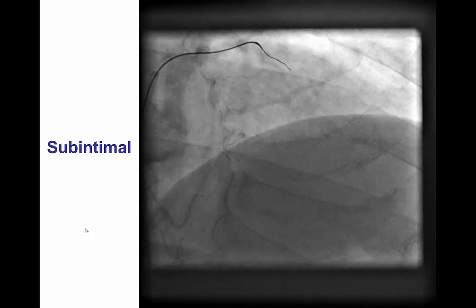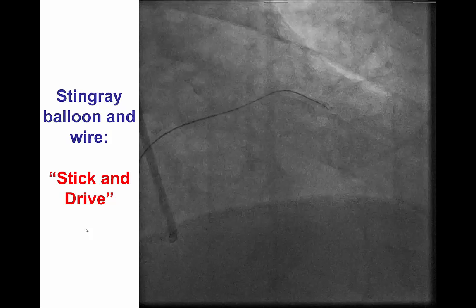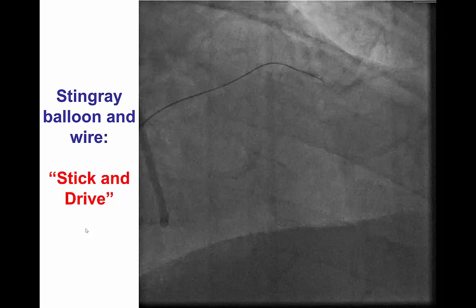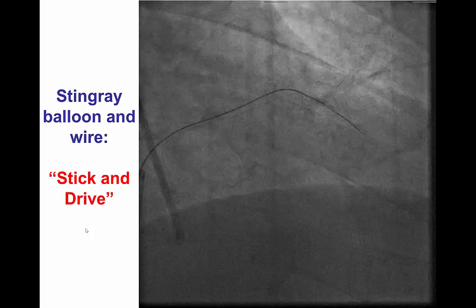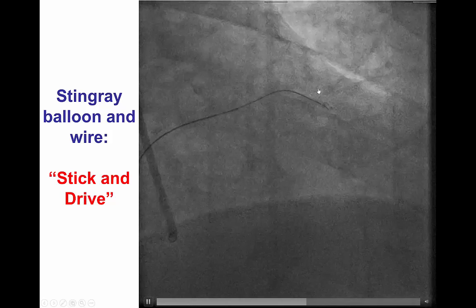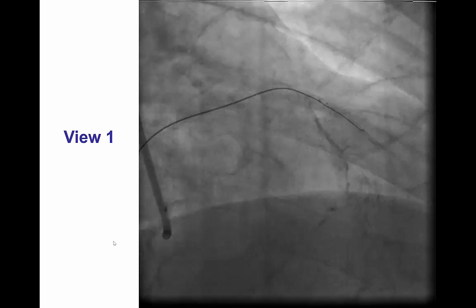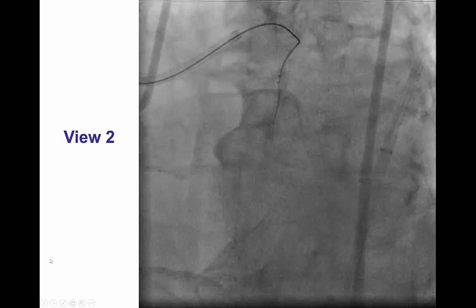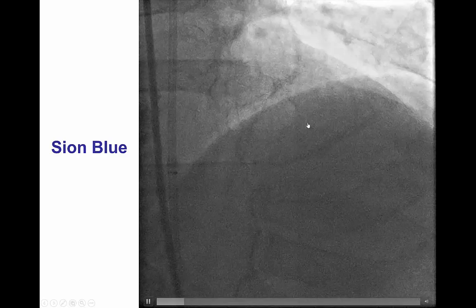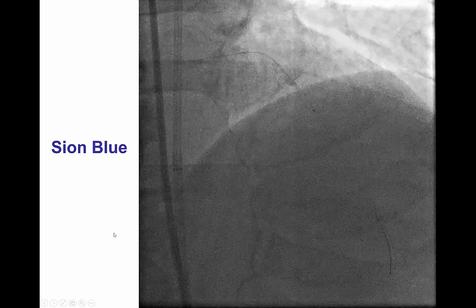As noted, subintimal crossing is actually one of the last-resort therapies for balloon uncrossable occlusions, so we were happy to gain access to the subintimal space. We were able to deliver a Stingray balloon and guide wire and perform re-entry with the Stingray wire using the stick-and-drive technique, entering the vessel proximal to the proximal marker. This was confirmed on contralateral RAO view and LAO cranial projection. The wire was exchanged for a workhorse guide wire that selected distal side branches, confirming distal true lumen crossing.